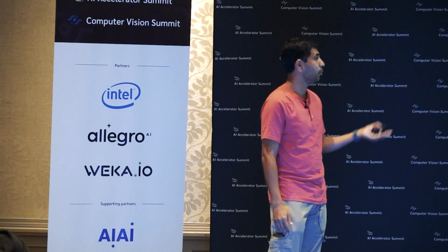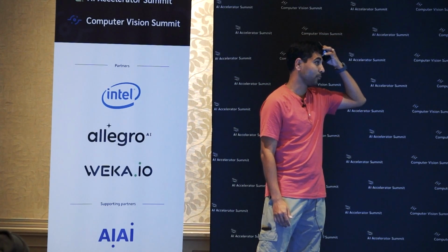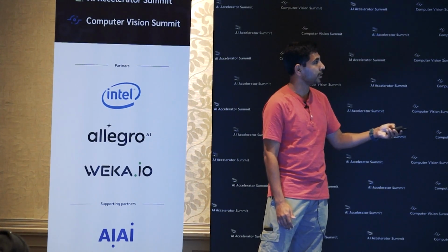And here I'm just going to show a model that was recently put out, which is sort of a next generation UNet. It's a fully convolutional network that goes from the raw image to a semantic map, where it's actually trying to identify where exactly the stone is. And they actually compared multiple models. Here they went from the image.